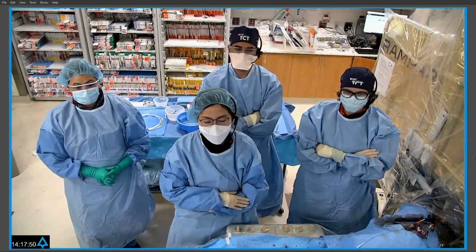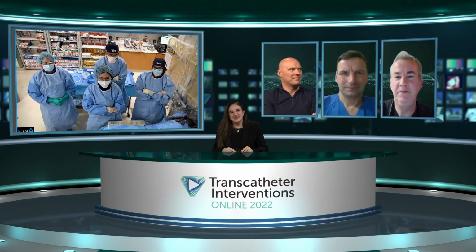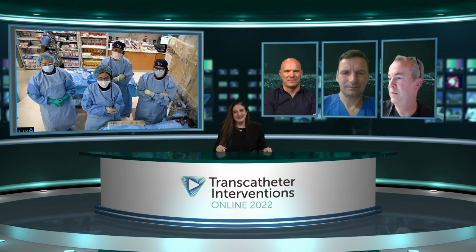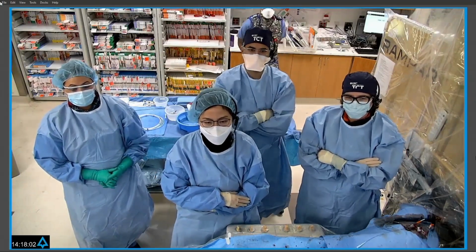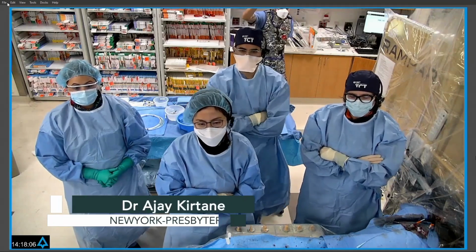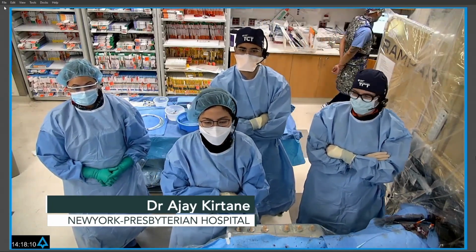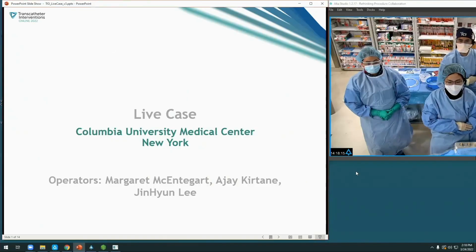Hi, everybody. Nice to see everybody. We got a good case for you, because time is limited. We'll try to get moving pretty quickly. Margaret needs no introduction. She's going to be doing this case. We have our CHIP fellow from Singapore, Deborah. We have Diane, Brian, Lourdes, Patty will be around too. So pretty awesome team for you, and a pretty interesting case too. So we'll go to the slides now, and we can show that. Okay, go ahead, Deborah.